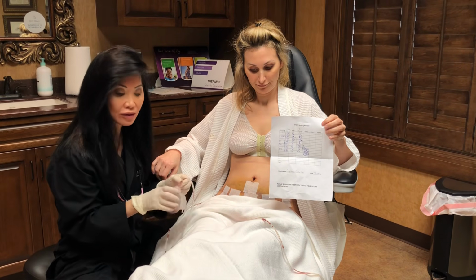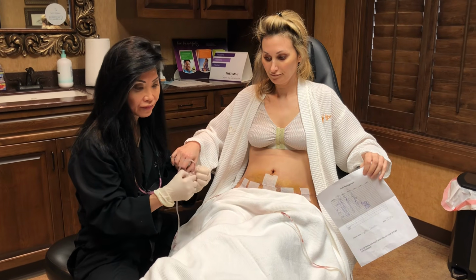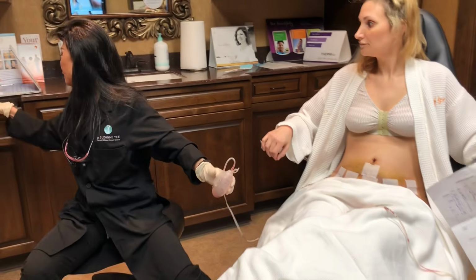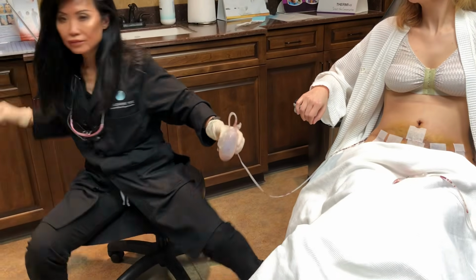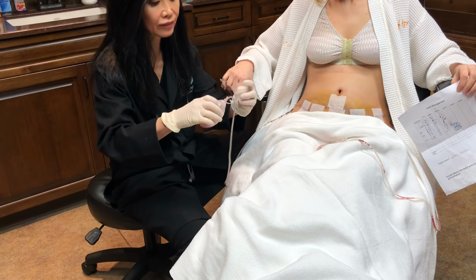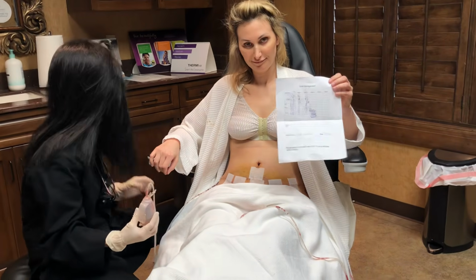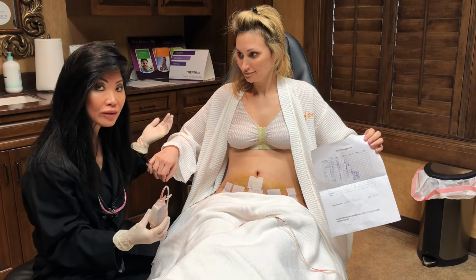So to empty the drain, you take the drain and you take the top off, and basically it lets the suction off, and then you just take this drain, let me just get it up real quick, and we empty the fluid into this cup, okay? And then you can measure the amount that's in there and then write it on the drain sheet. And this will help the nurse to calculate this over a 24-hour period, and then we can decide when to take the drain out.